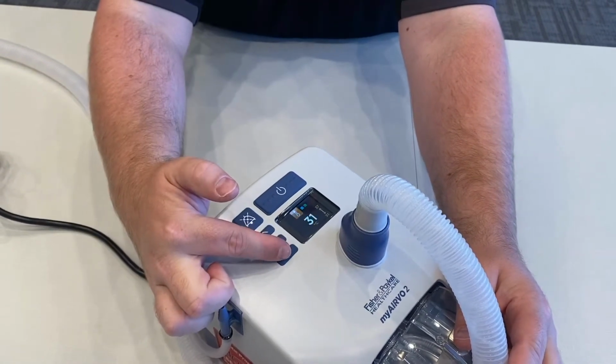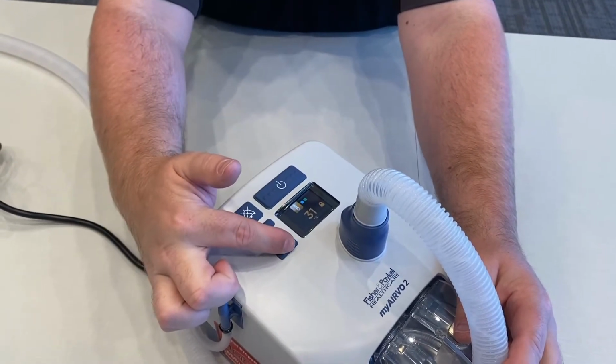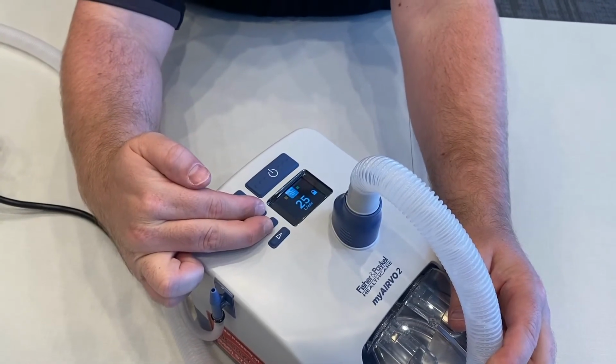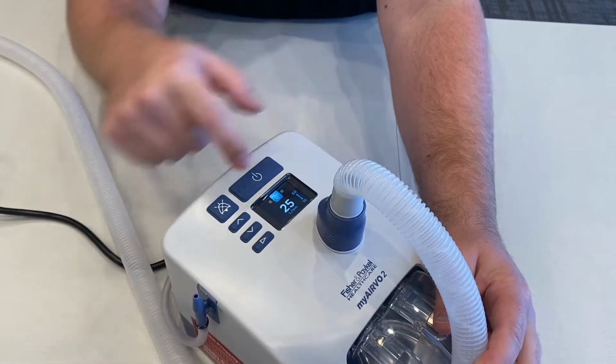When you're ready to select that setting, you just hit that play button again, and it locks it into place. To go to the next item, if you wanted to change the flow, you're going to do the same process. You're gonna hold the up and down arrow in place, and here we can change our liter flow. And again, we can go all the way from 10 all the way up to 60 if we want to.